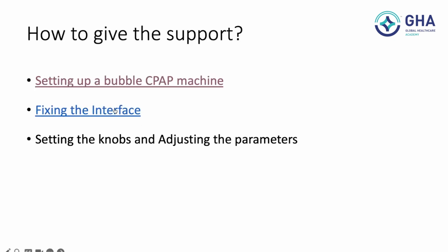Now the next step is to fix the interface. Now you keep the machine ready and the temperature should be 37 before you connect the machine to the baby. Now obviously to connect the machine to the baby, we need to fix the interface. We will look at one of the interfaces here.